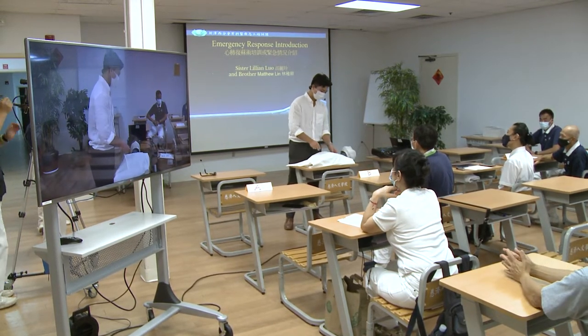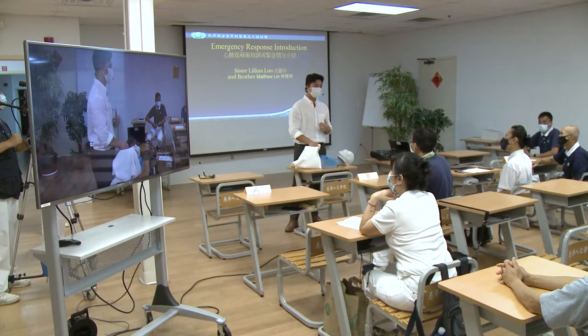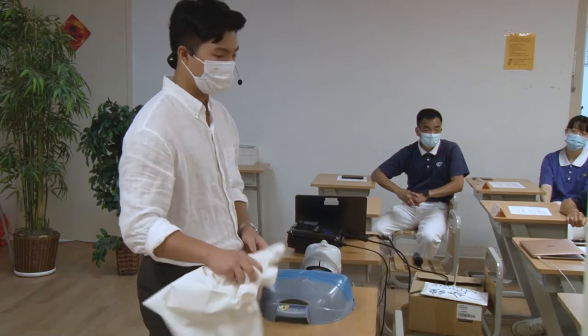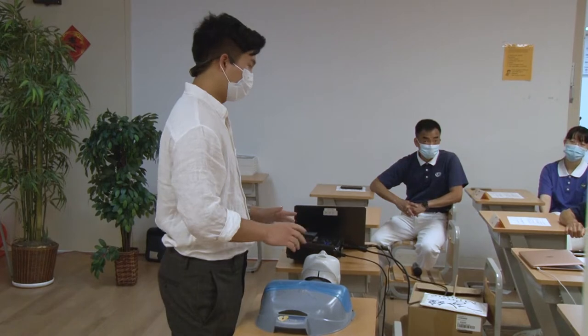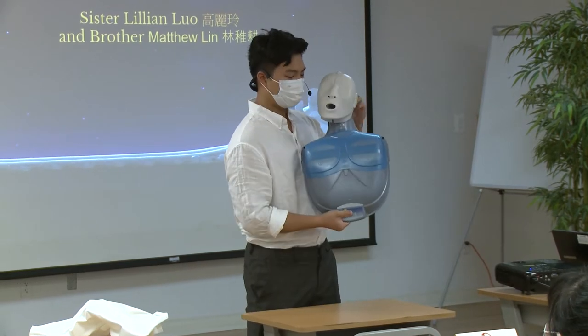But before you do that, you want to fully expose the patient, because for the AED, you need to apply the pads directly on the chest. You can't do that with clothes on, and it's a lot easier to just get rid of the shirt at the beginning. It doesn't matter if the patient's a male or a female. You take off the shirt, right? It's an emergency, no time for decency. This is the patient, right?